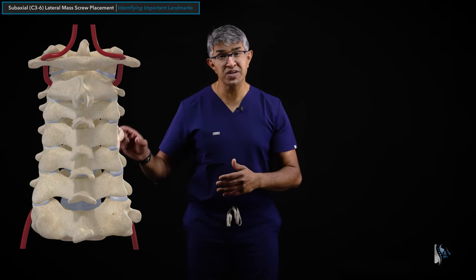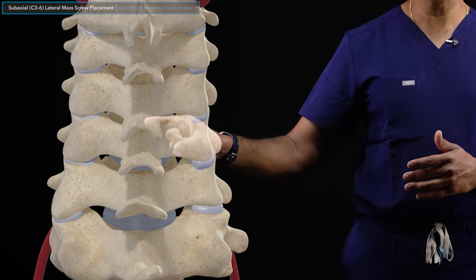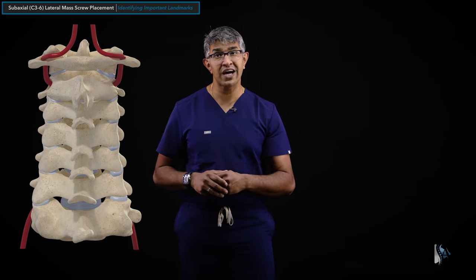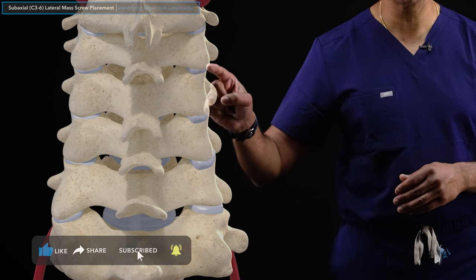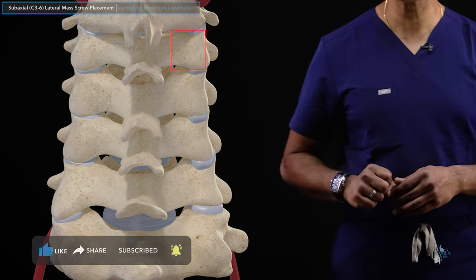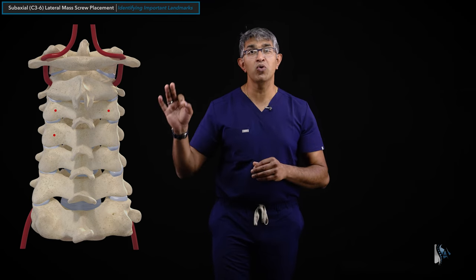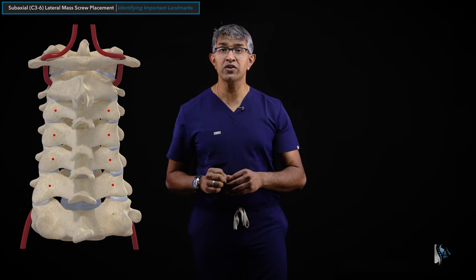Now let's identify appropriate landmarks for this dissection. Looking at this image from a posterior approach at the cervical spine - C3, 4, 5, 6, and 7 levels - those are the levels where you can consider putting in lateral mass screws. The boundaries of the lateral mass are clear: here's the bottom, here's the top, here's the lateral border - you can see this rectangle. The start points I generally use are the midpoints of the lateral mass, in both dimensions: medial-to-lateral and cranial-to-caudal.